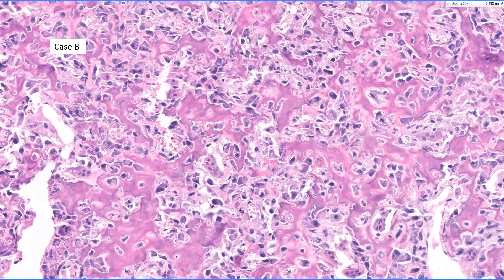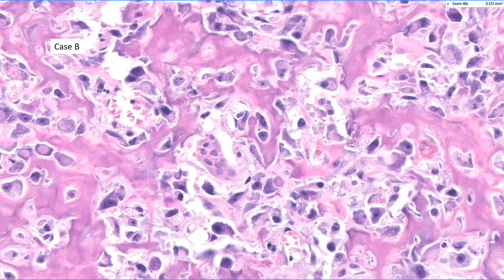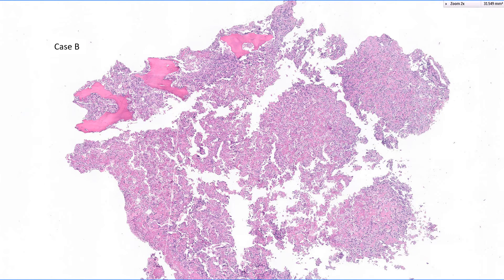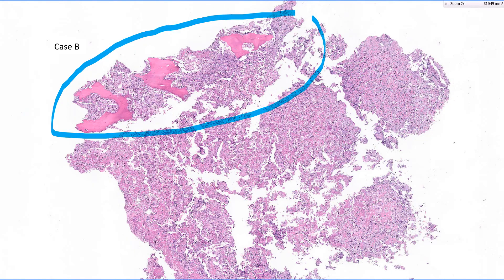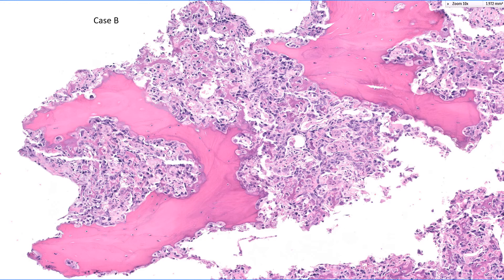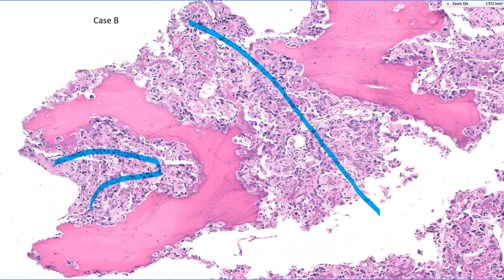Now for Case B (the lower images). Notice this lace-like deposition of osteoid — this bothers me; it's not typical for an osteoblastoma and is more like an osteosarcoma. Although if you look at the individual cells, there are osteoclasts, and the osteoblasts look epithelioid — perhaps the atypia alone doesn't do it for me. But alert: look at this pre-existing lamellar bone — bone that was there before the tumor ever appeared. This tumor is streaming between and encasing that pre-existing bone. This is diagnostic for an osteosarcoma.